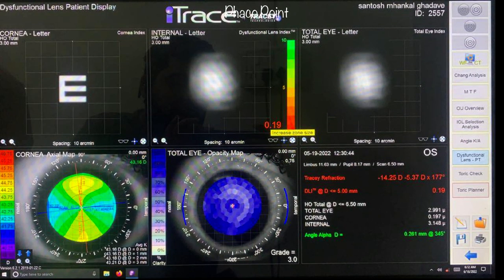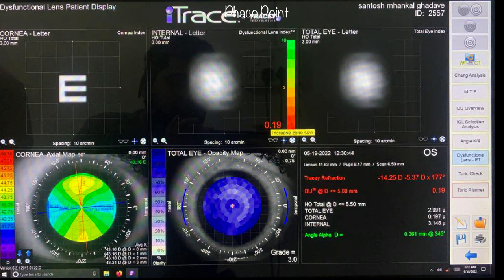Let's now look at the dysfunctional lens index, or DLI — an objective metric that measures how much of the patient's visual symptoms are contributed by the lens. A high DLI indicates the lens is not responsible for symptoms, while a lower DLI signifies a large contribution from the lens. In this case, the DLI is down to 0.19, signifying that a large part of the patient's symptoms are caused by the lens itself.